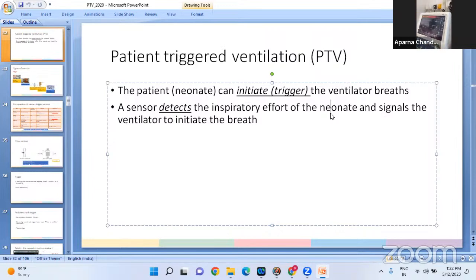And in all these modes, we will also be getting the delivered parameters here on the right side, like the delivered respiratory rate. Of course, now the baby is not breathing. The delivered FiO2, I time, PIP, etc. There are some additional parameters which will vary based on the mode that we choose.